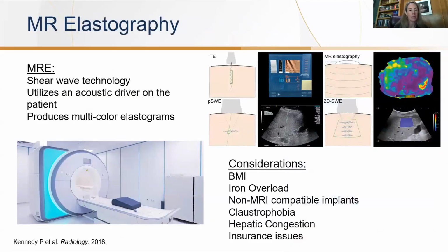Okay, so moving on to MR elastography. So this is again shear wave technology. It utilizes an acoustic driver on the patient and produces these very nice multicolor elastograms. MRE is a great test, probably the gold standard non-invasive test for fibrosis. And we would love to do more of them.